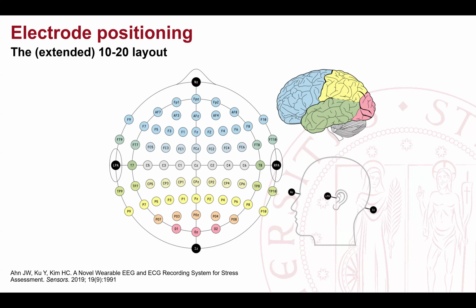The point is actually this. Depending on what electrode we use, the waveform changes, yes, completely. You can record the EEG signal with a certain reference, but you can also change it afterwards, because you can re-reference by subtracting after. But in the state of the art, the convention, the standard is to place it in a fixed position, because otherwise we cannot replicate.